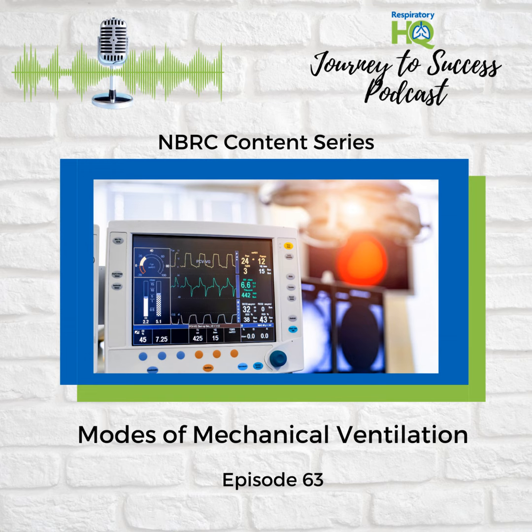Anything that stands out as particularly important or cutting edge in the field right now? Well, there's one area that's incredibly exciting and has the potential to revolutionize the way we approach mechanical ventilation. Closed-loop ventilation. It's a relatively new development, but it's already generating a lot of buzz in the respiratory care community. Closed-loop ventilation. That sounds intriguing. It is. Imagine a ventilator that can not only monitor a patient's breathing, but also automatically adjust its own settings in real time based on the patient's needs. That's essentially what closed-loop ventilation aims to do.